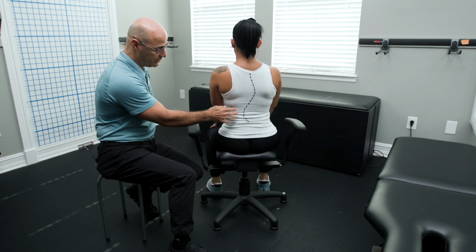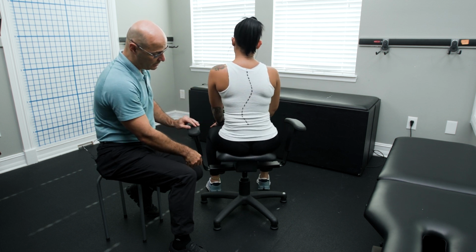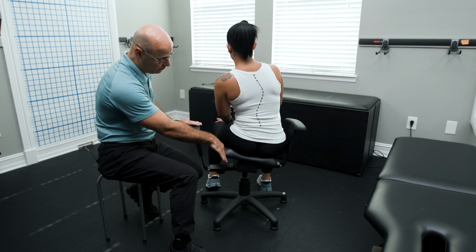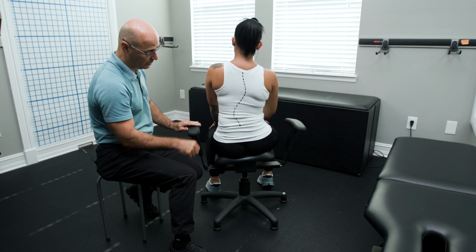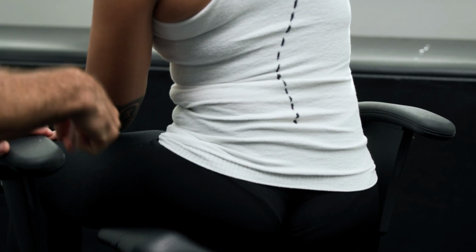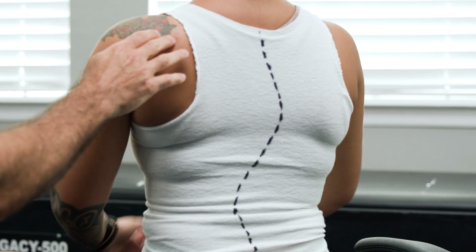The next motion is going to be lateral flexion. So she's going to bend left and bend right. And you can see how she gets full motion, and the chair is moving under her. And it allows these discs to pivot right through the nucleus of the disc to allow better flexibility into those disc areas. And then the last one is going to be spinal rotation or twisting.